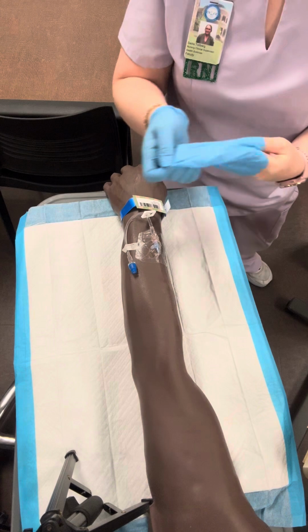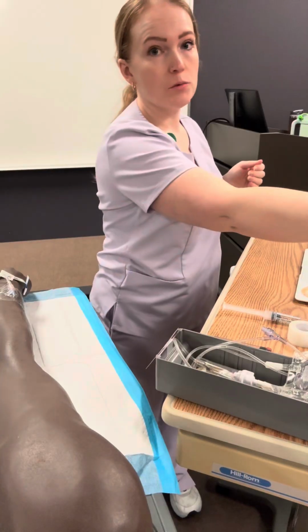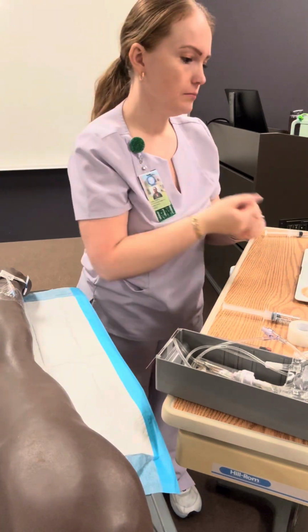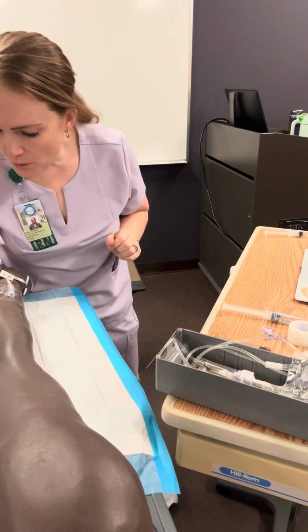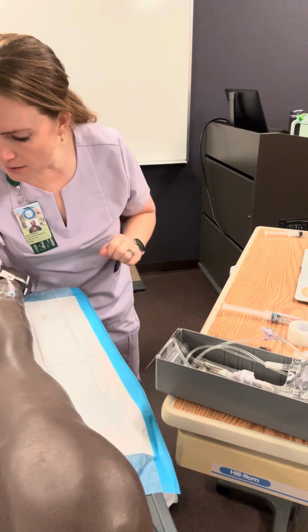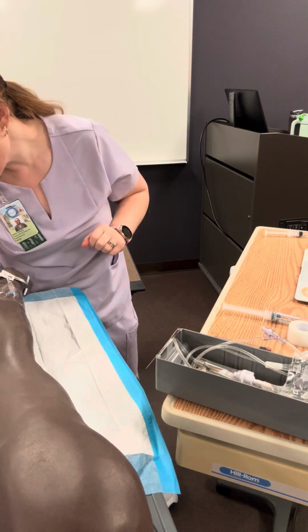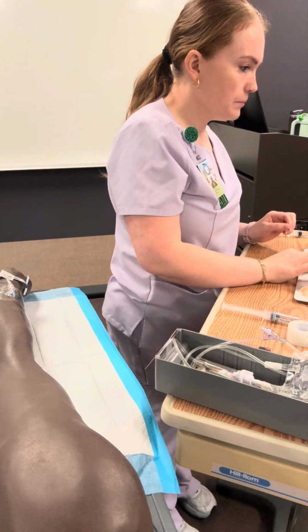I'm going to remove my soiled gloves, perform hand hygiene, and I'm going to label with the date, the time, and my initials. All right.